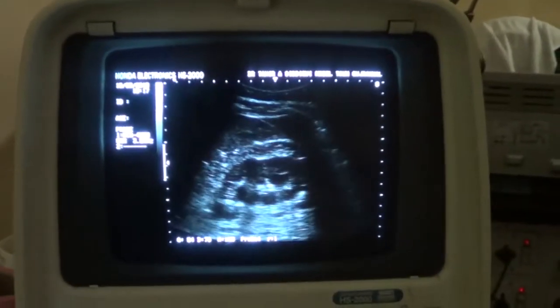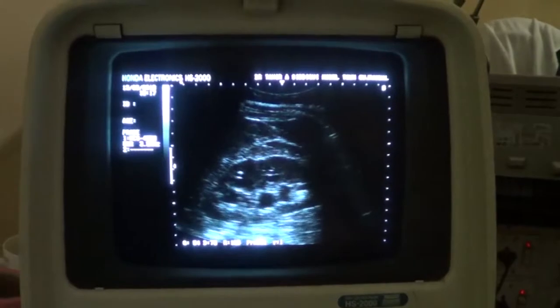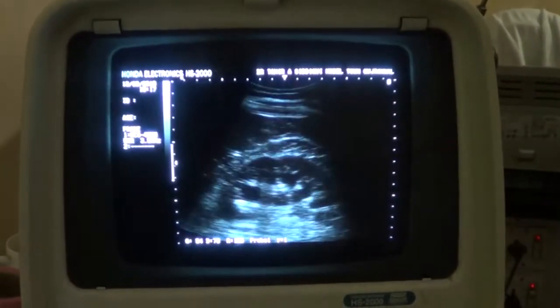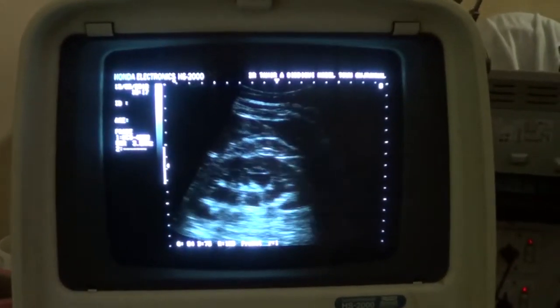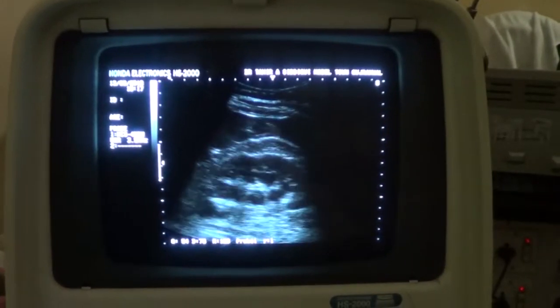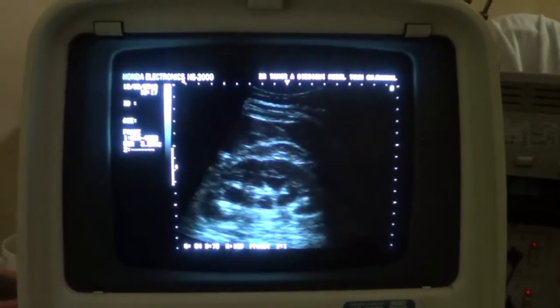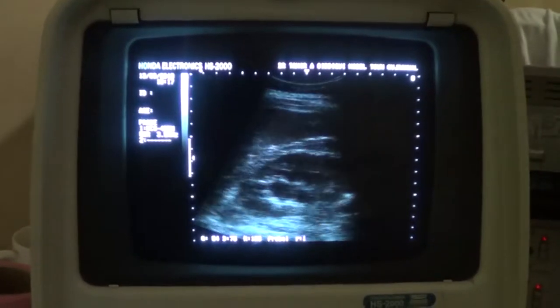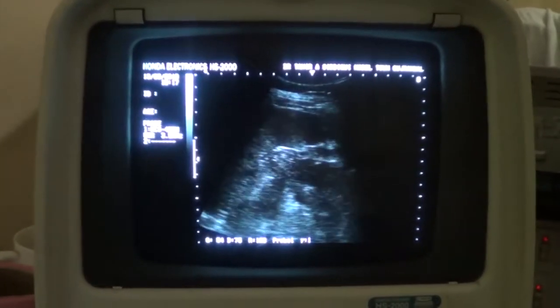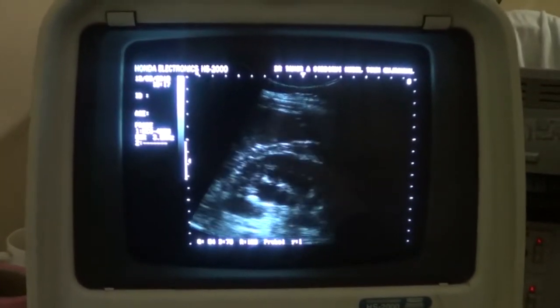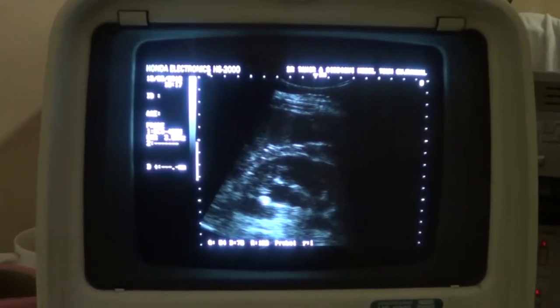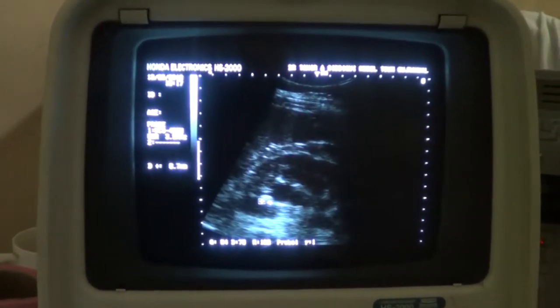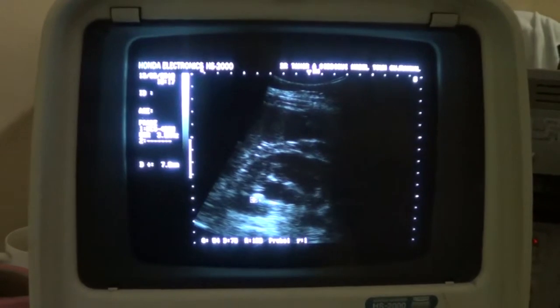This is the ultrasound study of the left kidney of a patient with urinary colic, in which we see a calculus in the upper pole of the left kidney. This is the calculus at the upper pole, measuring approximately seven millimeters.